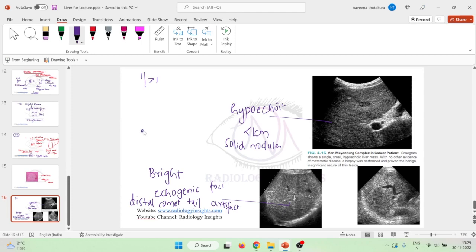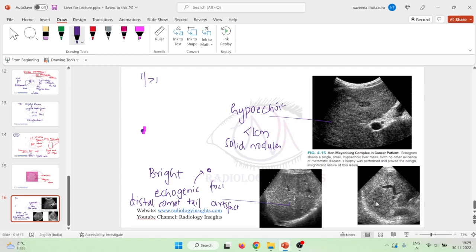The distal comet tail artifact means the echogenic focus is surrounded by something like a comet tail. These echogenic foci are mainly because of cysts which are beyond the ultrasonography resolution. One cyst may look like a cyst, but the others look like dots — actually they are also cysts, and these can be diagnosed by CECT. Similarly, a von Mayenberg complex patient shows many echogenic foci along with some hypoechoic solid nodules less than one centimeter.